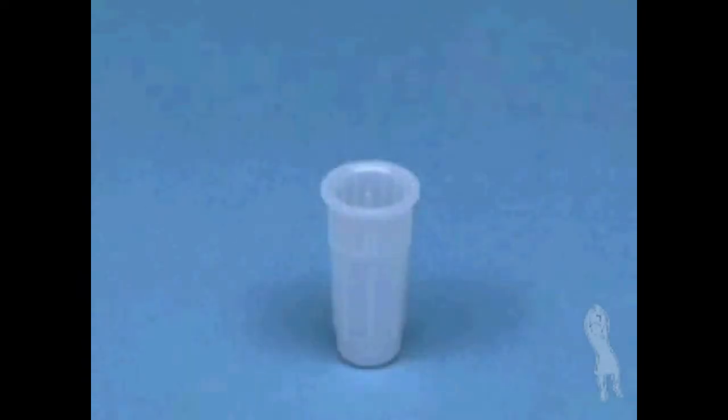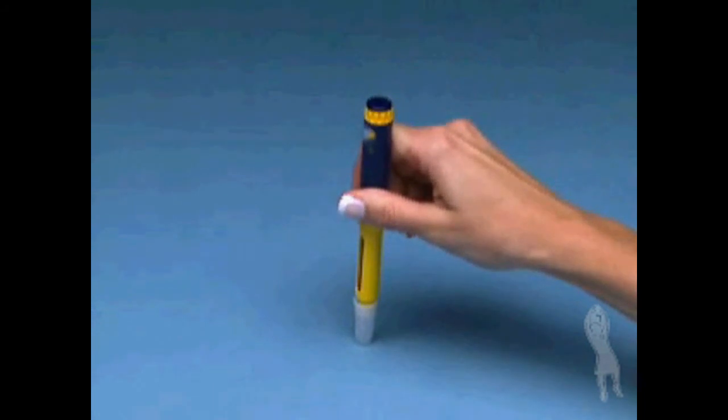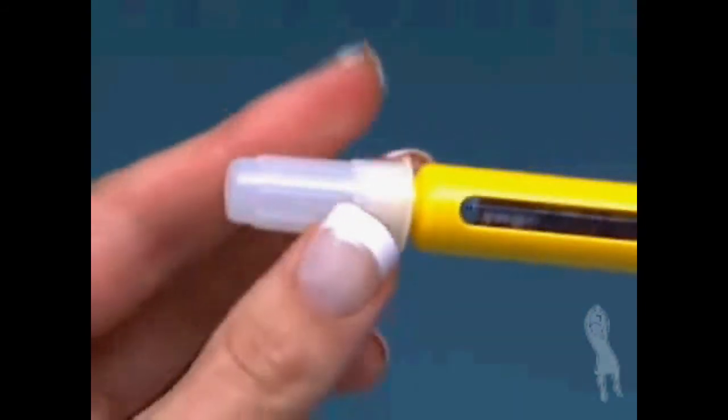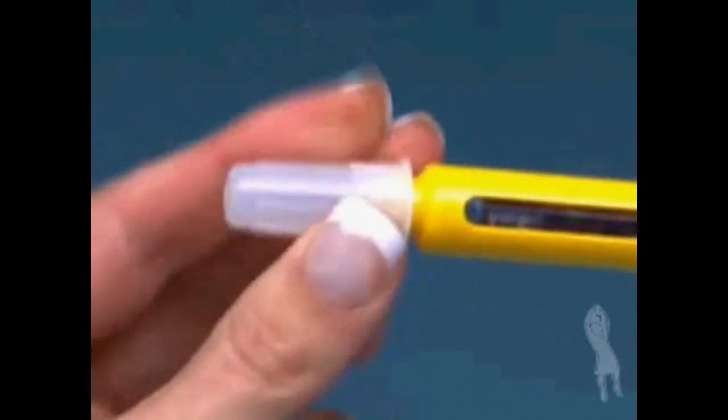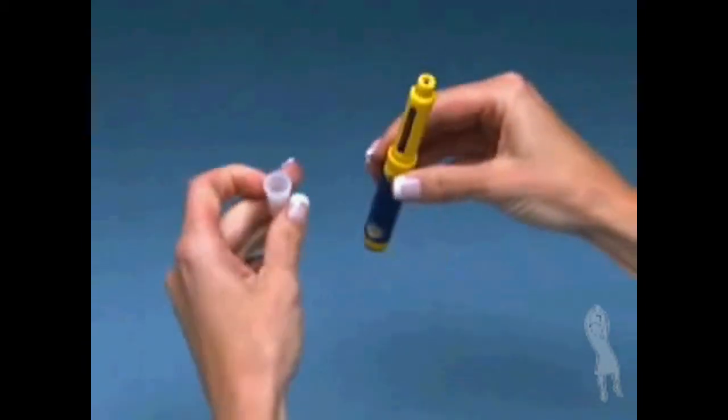Place the outer needle shield on a flat table surface with the opening pointing upward. Without holding onto the outer needle shield, carefully insert the needle attached to the Follistim pen into the opening of the outer needle shield and push down firmly. The outer needle shield should now be attached to the cartridge holder and cover the needle. Grip the outer needle shield and use it to unscrew the needle from the cartridge holder.